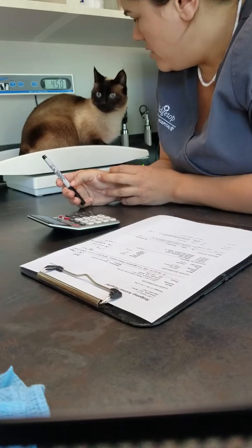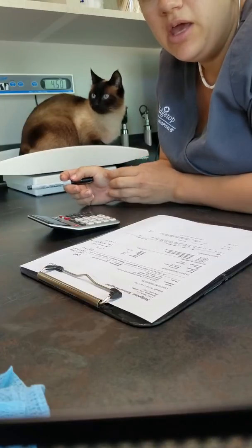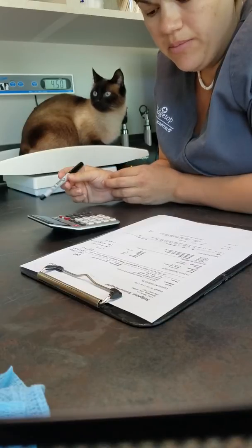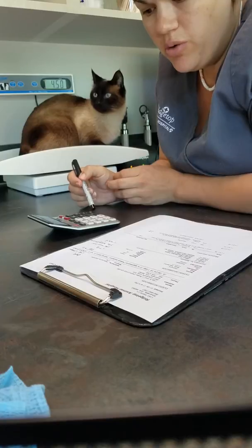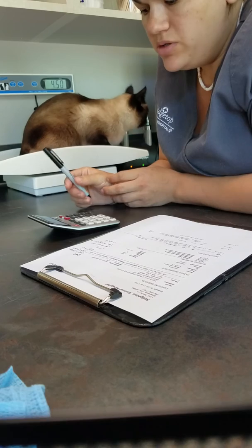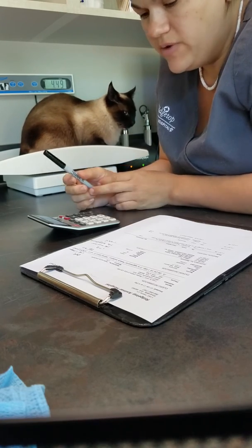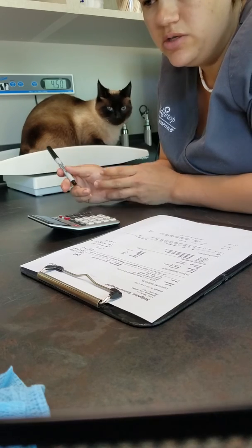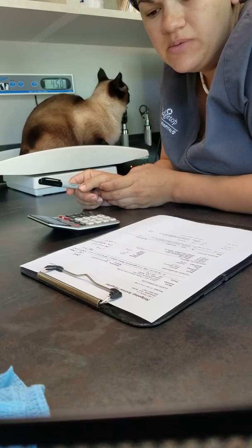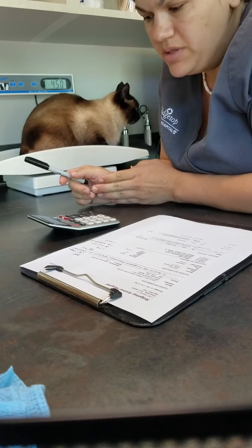He's healthy. But for a patient that I'd be checking in, I would be letting the doctor know that it was below the 100, or above the 102.5. Above the 102.5 could indicate a fever of some sort, or it could be that they're nervous. So either way, you want to tell the doctor, because you don't know if it's them being nervous or scared or worked up, or if it's some kind of disease process happening with the patient. So either way, anything out of those normal limits, you want to let the doctor know.